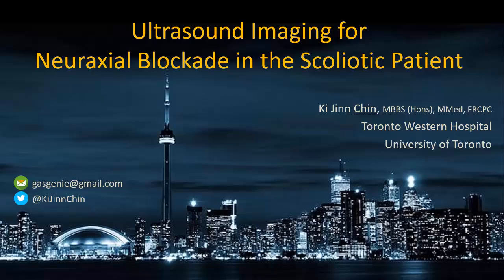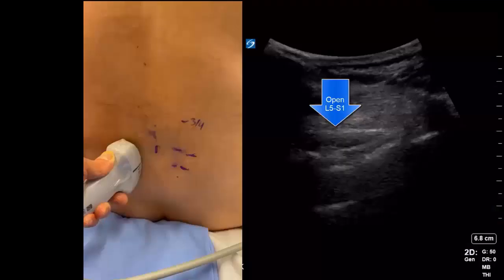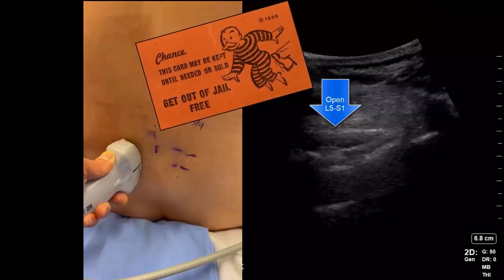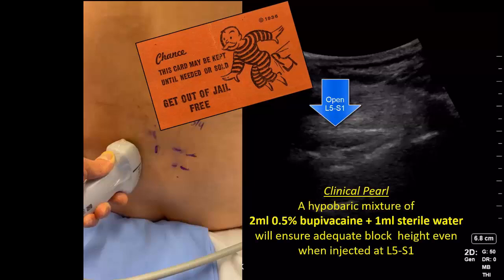Time to get out the ultrasound then. Placing the probe in the left parasagittal view, we obtain a good view of the L5-S1 space, which is immediately reassuring. This is what I refer to as my get-out-of-jail-free option. The L5-S1 space is almost always open when the other spaces are closed. I use a mix of plain bupivacaine diluted with sterile water, which is significantly hypobaric and in my hands at least removes any concerns about adequate block height for hip surgery.